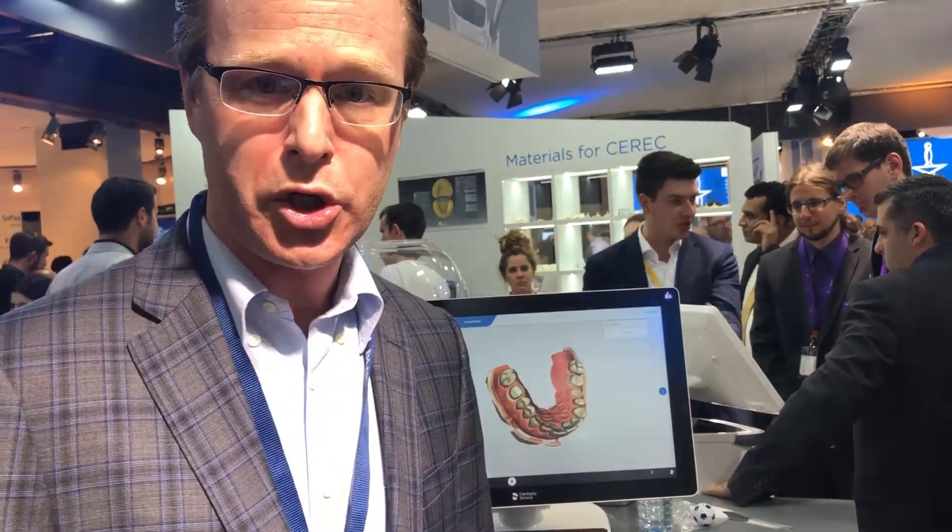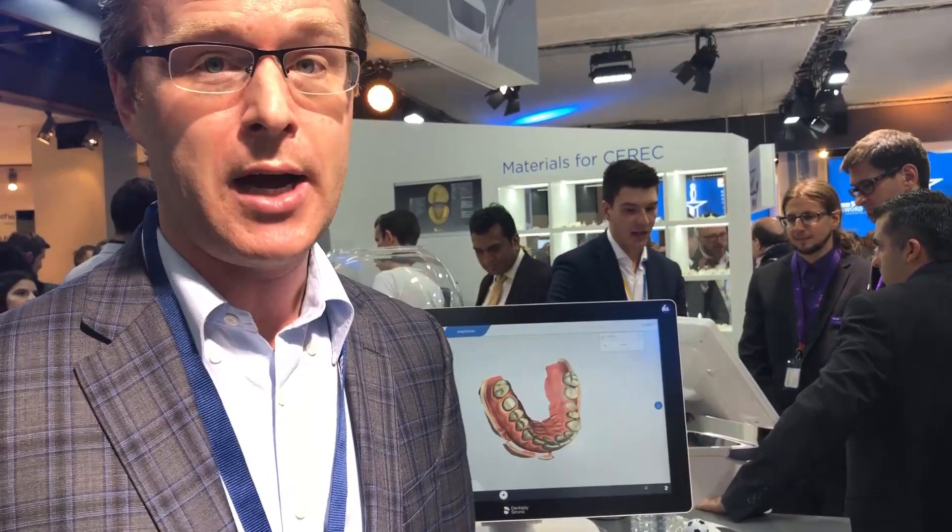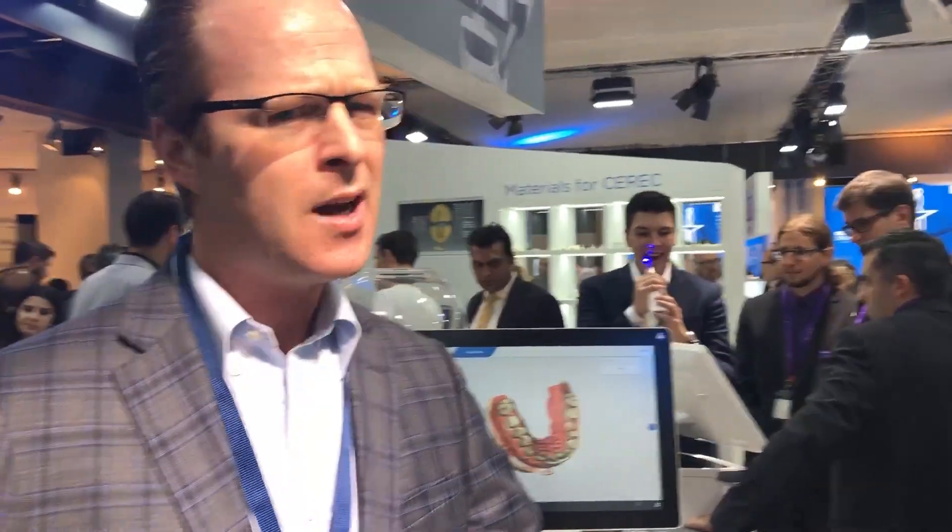So I look forward to seeing what Dentsply Sirona does with this machine. Hopefully someday they can get the weight and the size of the scanner down a little bit — that's going to be a challenge for some users. And certainly their price point is extremely high: approximately $43,000 to $45,000 for just the scanner, and approximately $70,000 if you want the CEREC software.